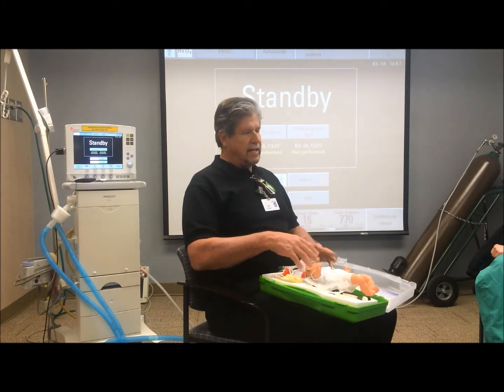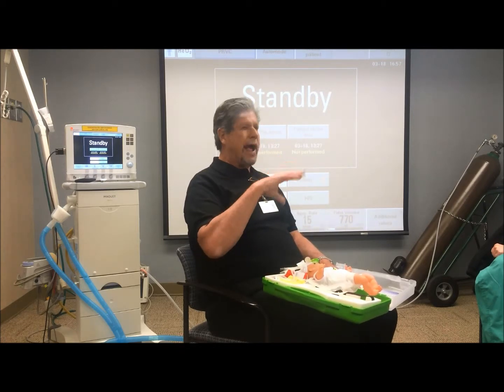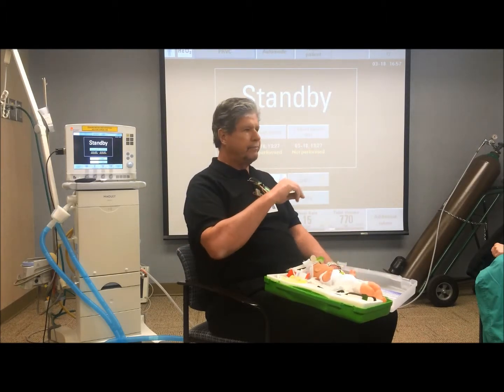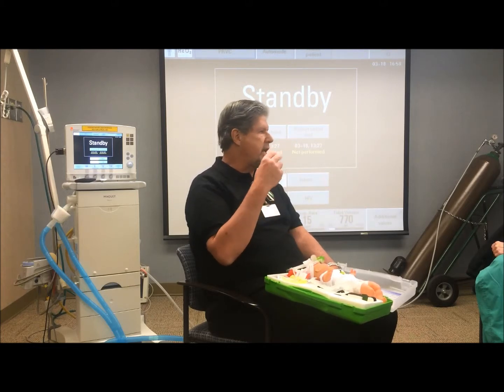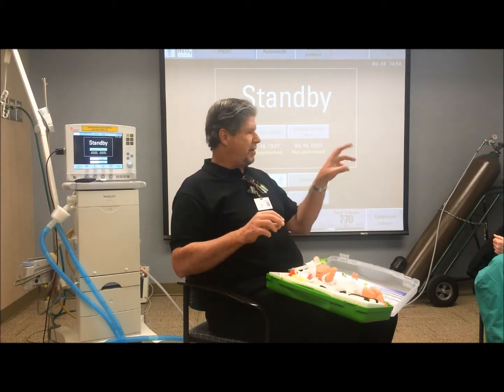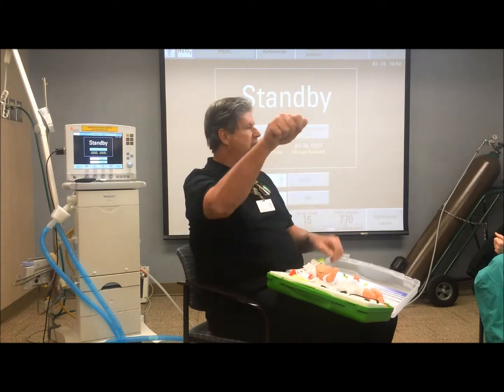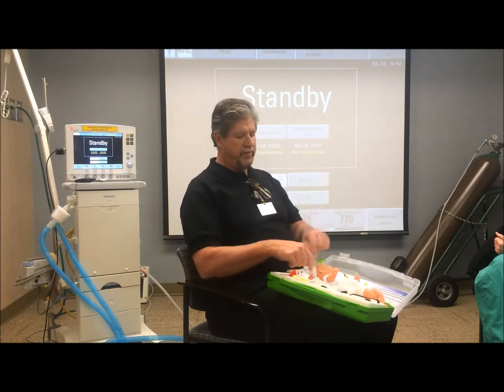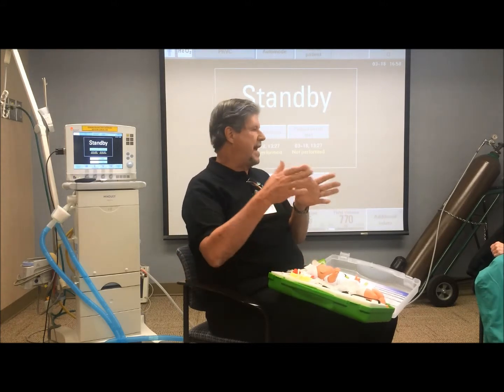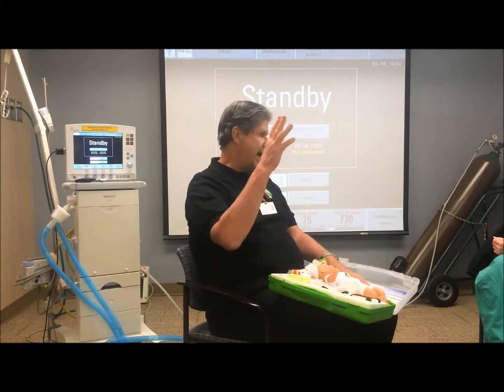Well, with a device like this, and also Fisher-Paykel has a similar system, the problem that I see as a practical therapist is, you'd say, well, I'm gonna order 20 smalls, 20 mediums, and 20 large, let's say, of the prongs. And then you'd have a little box, and you'd put them in there, so that when you went to do this on a baby, you'd have to grab a mini flow out of the mini flow box. You'd have to grab small, because you've already measured, so you need small prongs. And then you'd have to have another box that had the different hats in it. So when you order them, you would order them that way. You'd order 10 of this, or 5 of that, or 8 of this, or whatever.